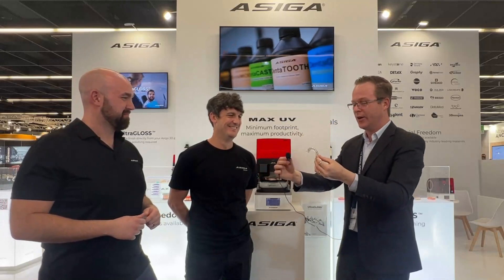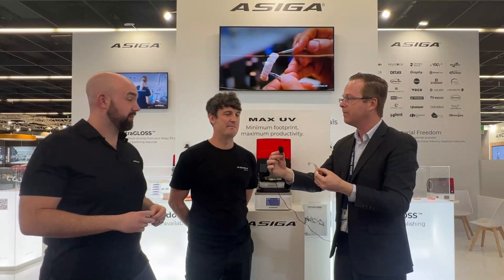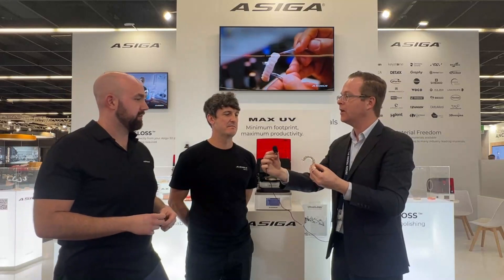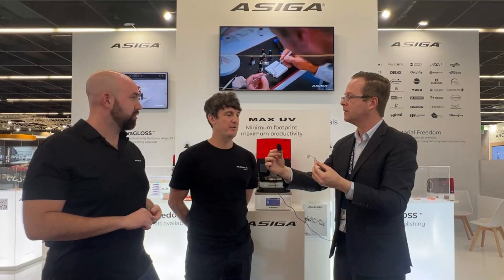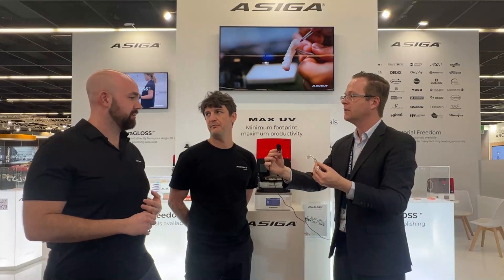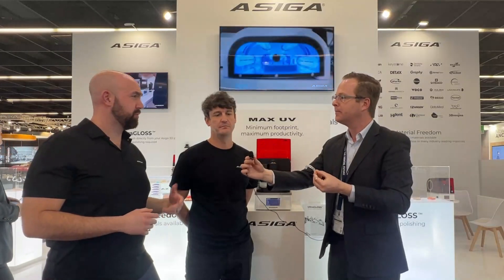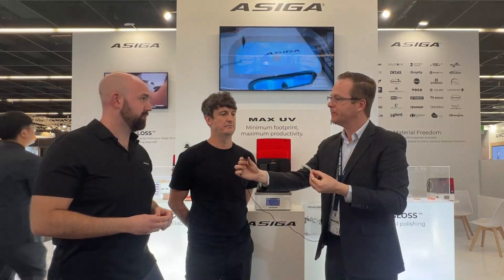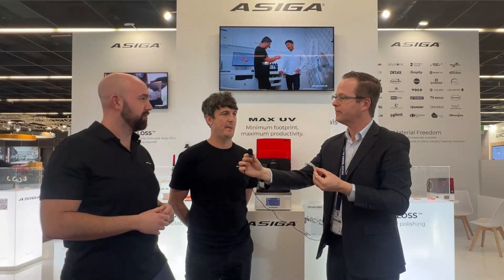Is Ultra Gloss available in North America and the US market? It's going to be available globally. It should start shipping in early April. If you're a dentist watching this, where do you get it? Just reach out to your favorite Ossiga reseller and they'll be able to take an order and get you set up with Ultra Gloss.